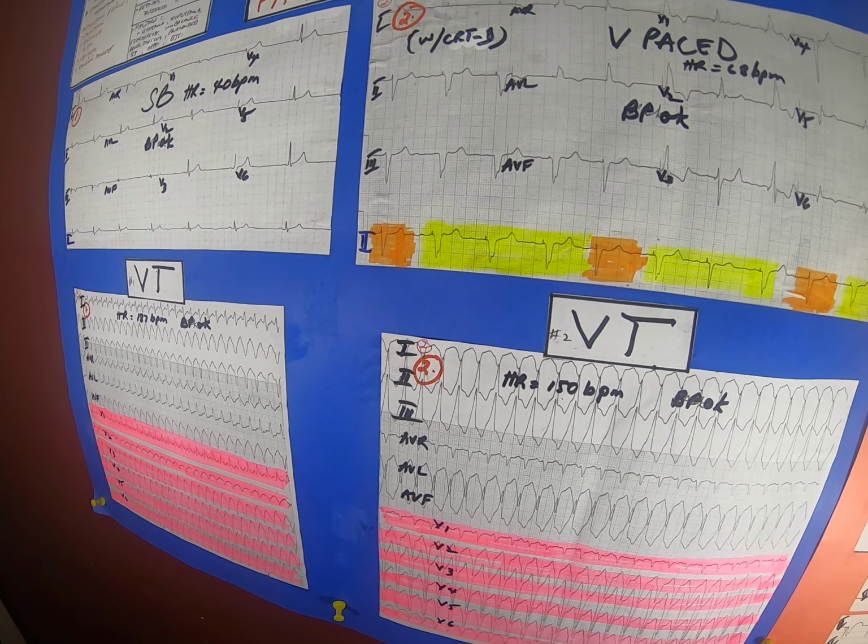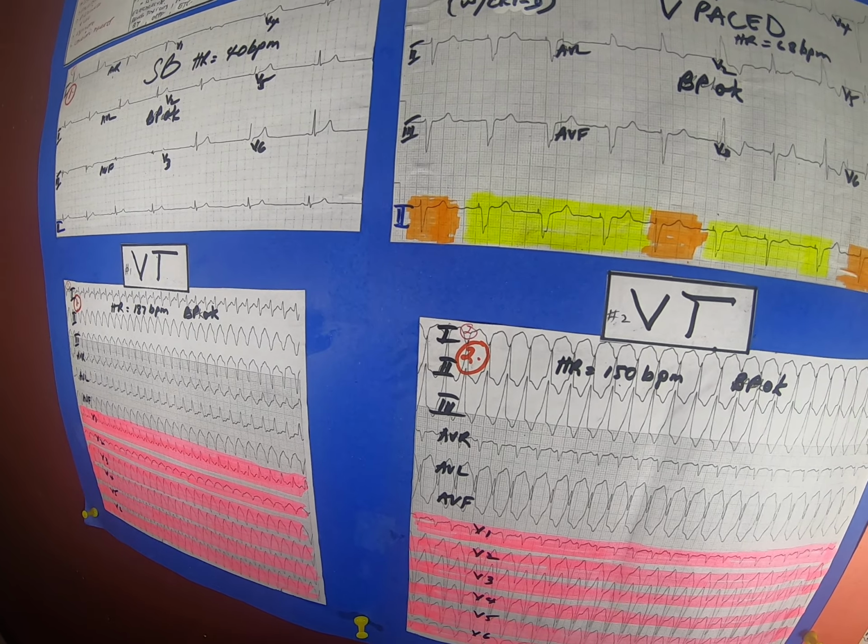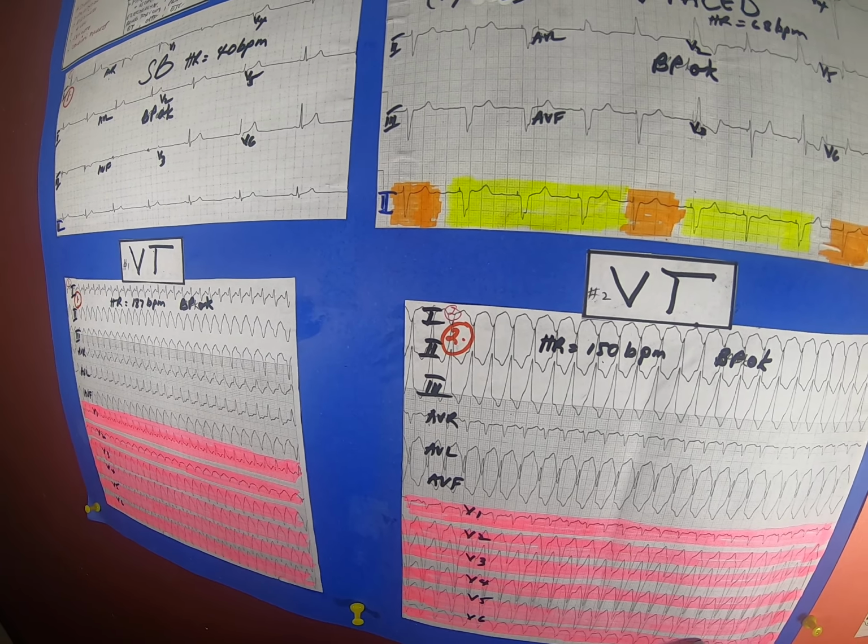So what is the plan of our doctor? So the doctor dealing with this problem is an electrophysiologist, and he's going to interrogate the device.